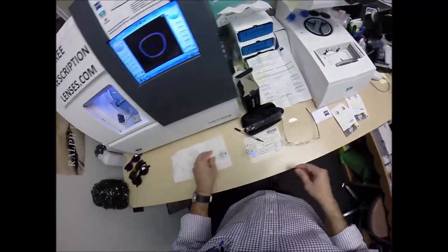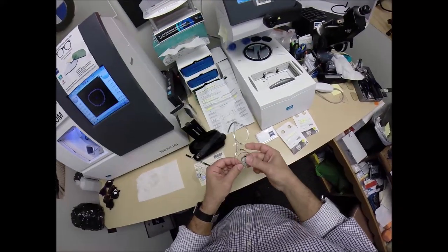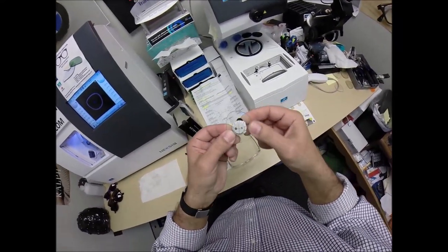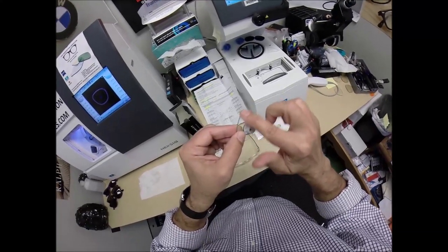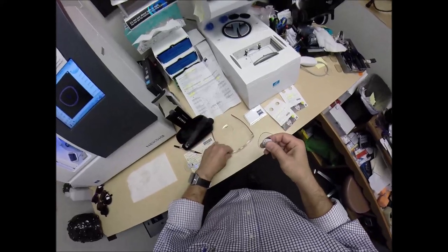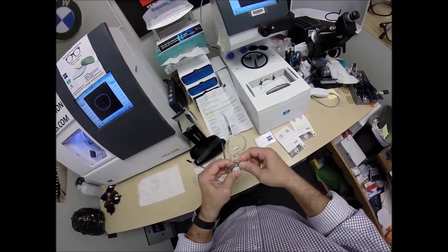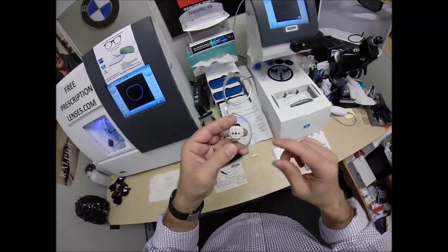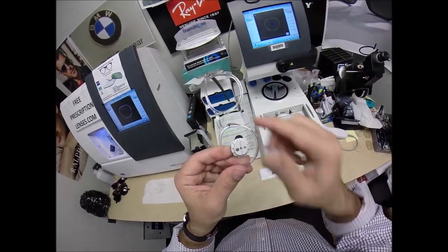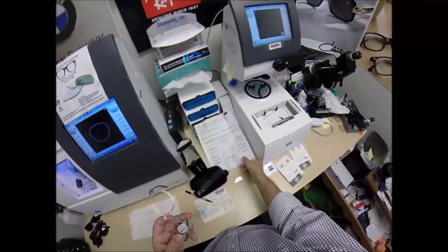So I'm just going to get the last of the optical sawdust off. I'm going to tuck the lens in at the outside corner. The reason you always hear me say I don't put a safety bevel on the front surface of the lens is that it's really not that rough. But I do put one on the rear surface, because if the lens is too large to go in the first time, and let's see, as I run my fingers around, it snaps in there easily. But if it were too large, I don't want any sharp edges coming in contact with your frame as I press down onto it. I do not want to mar your frame.